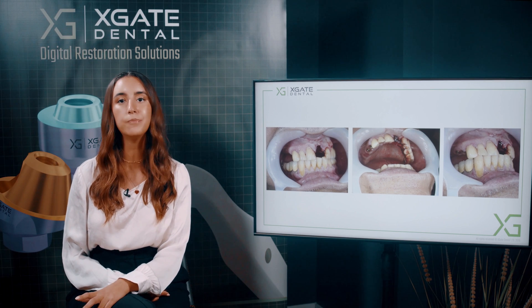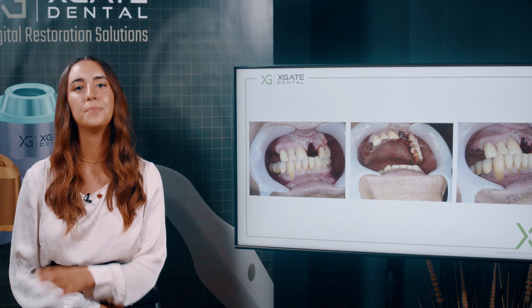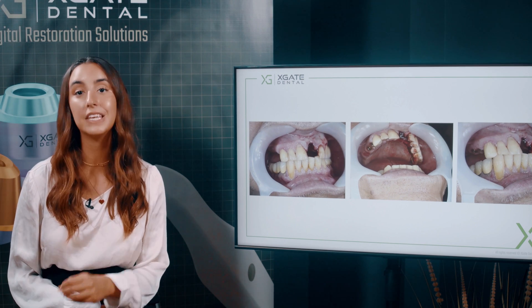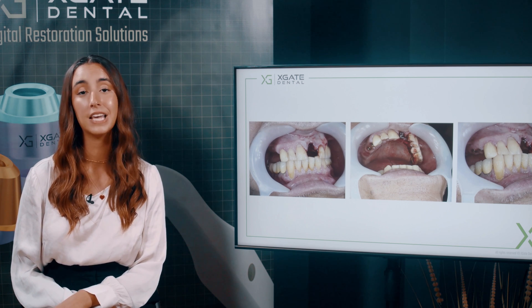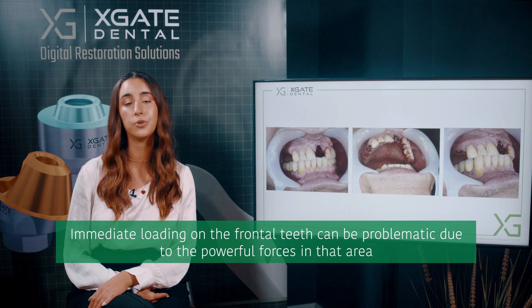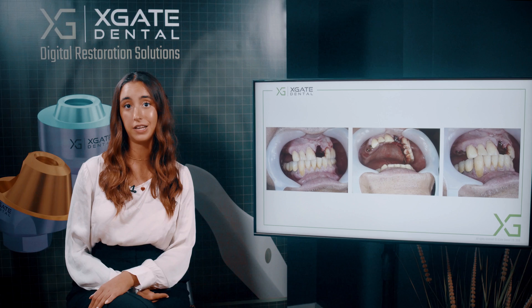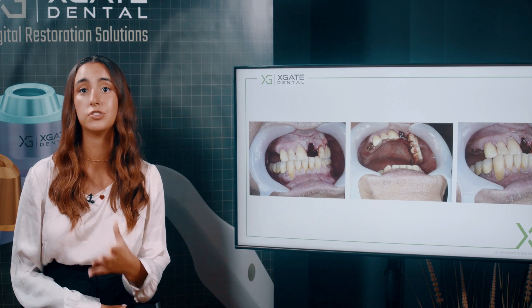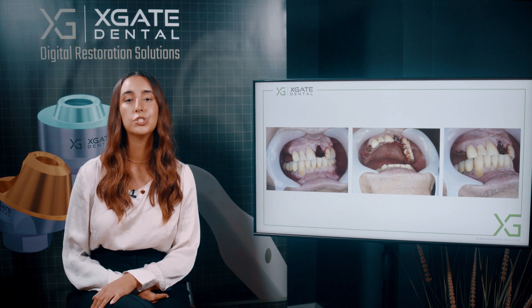Of course you can have an immediate implant placement and even immediate loading, but if you have immediate loading on a frontal tooth you'll have pressure on that tooth. Immediate implant placement with immediate restoration is a problem in frontal teeth because they have a lot of vertical forces, and it can interfere with the osseointegration. We can't be sure that we'll get proper osseointegration.